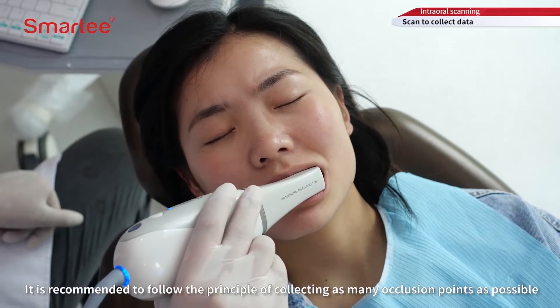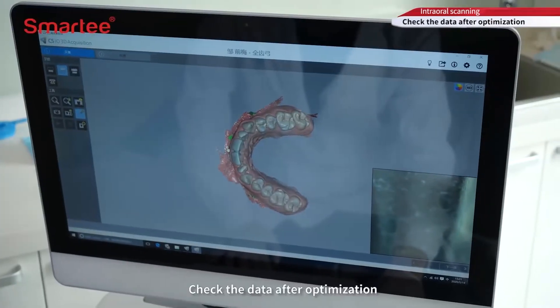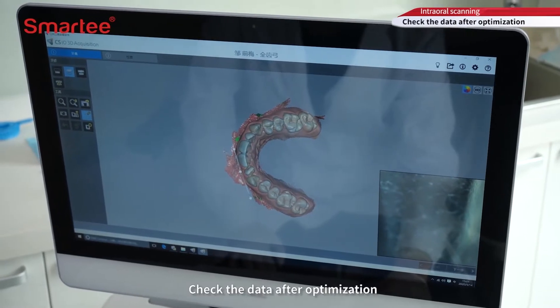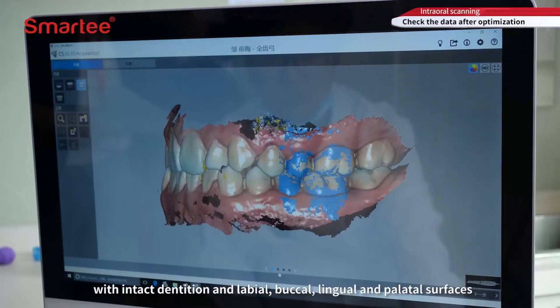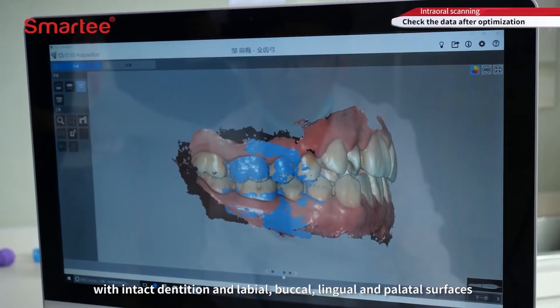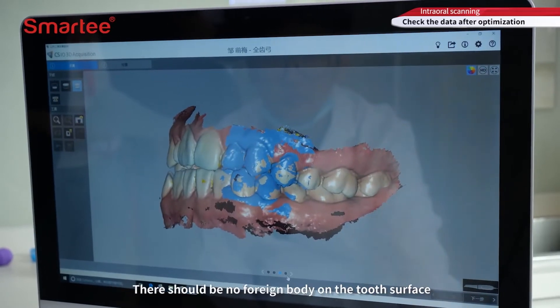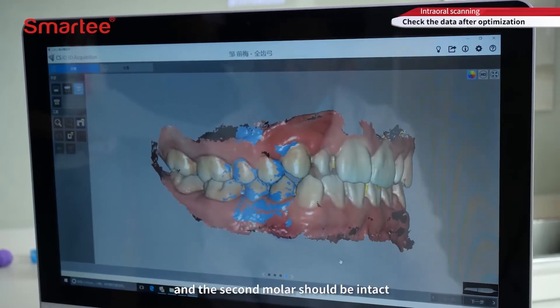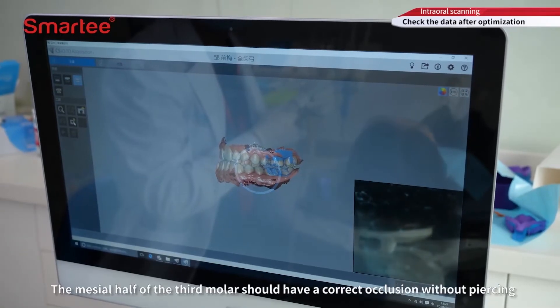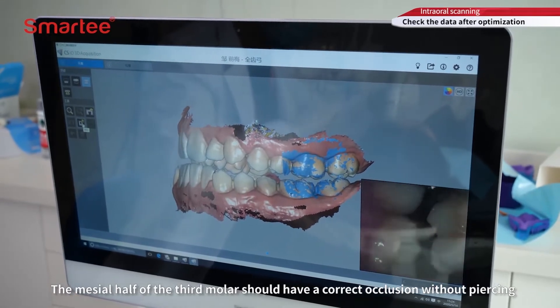Check the data after optimization. The cervical margin should be clear and continuous, with intact dentition and labial, buccal, lingual, and palatal surfaces. There should be no foreign body on the tooth surface, and the second molar should be intact. The mesial half of the third molar should have correct occlusion without piercing.